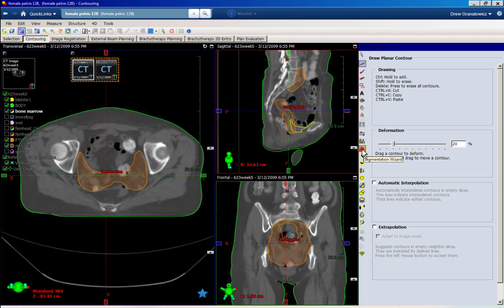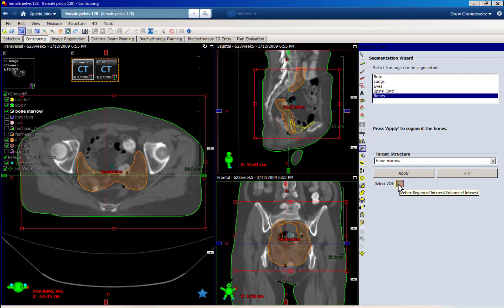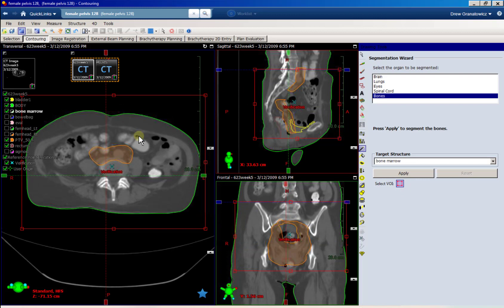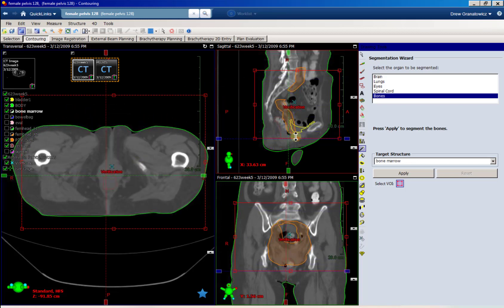The first step is we're gonna use the segmentation wizard bones and use the 'Select VOI box.' I already have mine set up — I have the top border, the superior border, looks pretty close. This pelvic bone right here ends about here, so I'm gonna move that down just a hair and match that. That's my superior border. The inferior border is right where those bones end. Everything else I want to include.